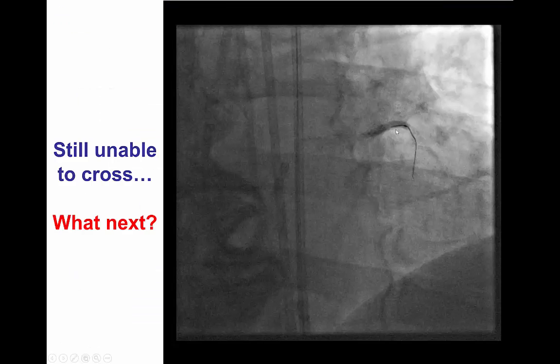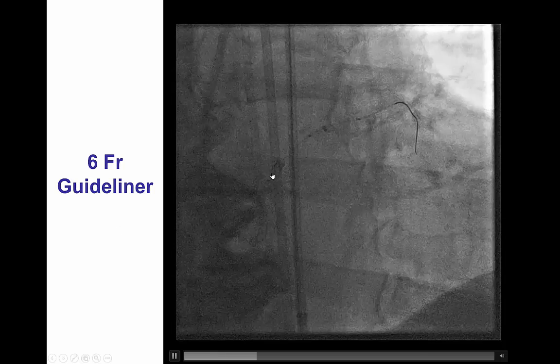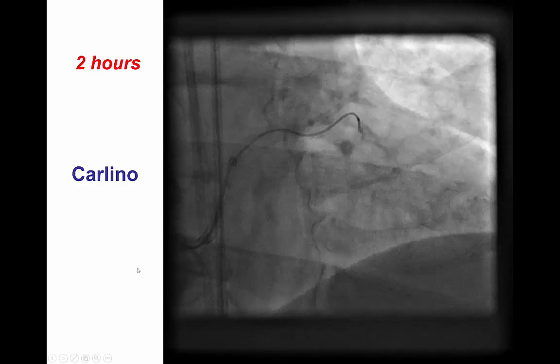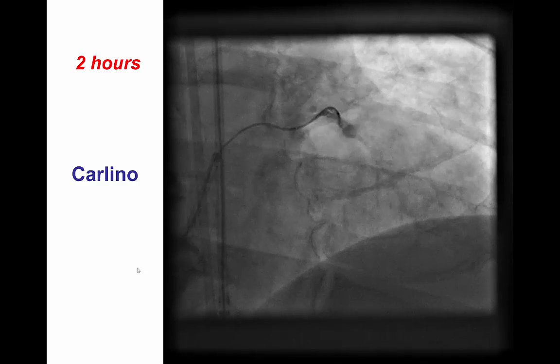We performed multiple dilations of the vessel proximal to the occlusion, since this could potentially improve traction and force of the catheter. However, this did not help. We then tried to increase guide catheter support by inserting a 6-French GuideLiner using a small balloon essentially all the way to the proximal cap. However, despite doing that, we were still unable to cross.